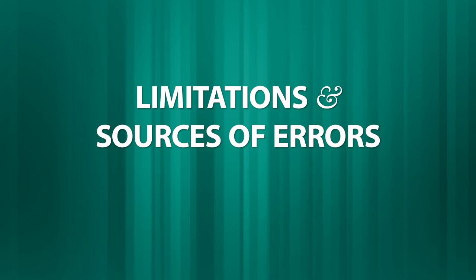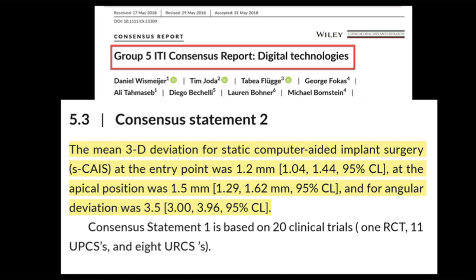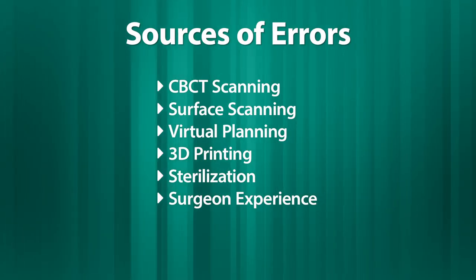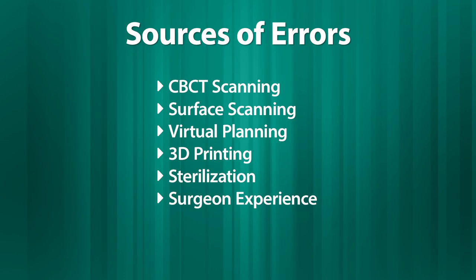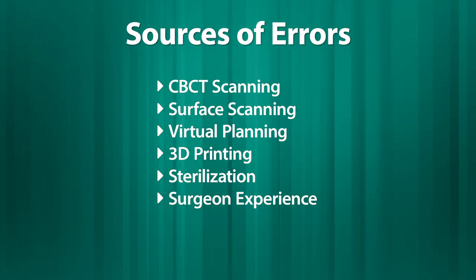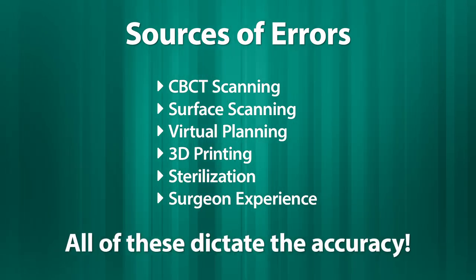The last part of my presentation is about the limitations of computer-guided implant surgery and the sources of errors. A recent article discussing the different consensus about the use of digital technology showed that the mean deviations of computer-guided implant surgery at the entry point was 1.2 mm, at the apical position it was 1.5 mm, and for angular deviation it was 3.5. Such sources of errors could be attributed to multiple factors such as CBCT acquisition, surface scanning, virtual planning, 3D printing, sterilization of the surgical guides and its supporting structures, and surgeon experience. All these factors together dictate the accuracy of the final product.